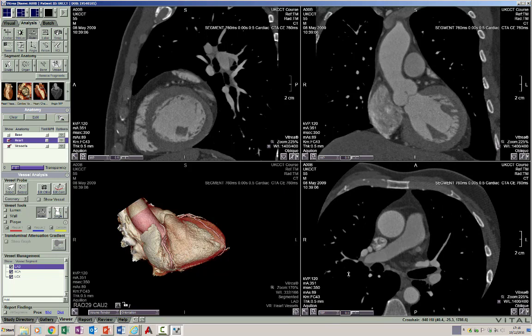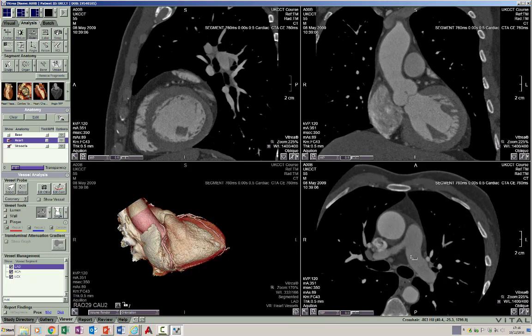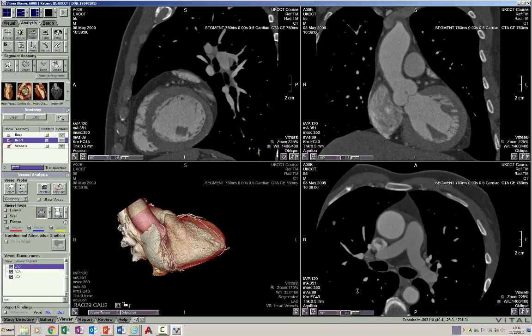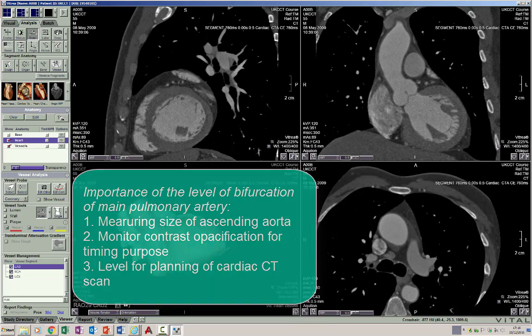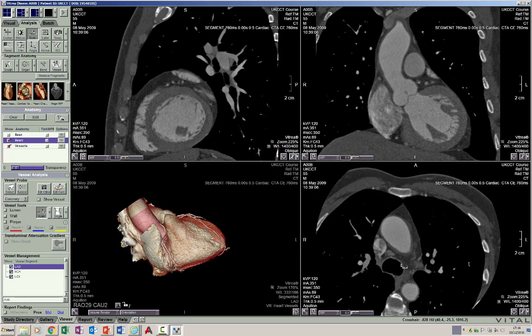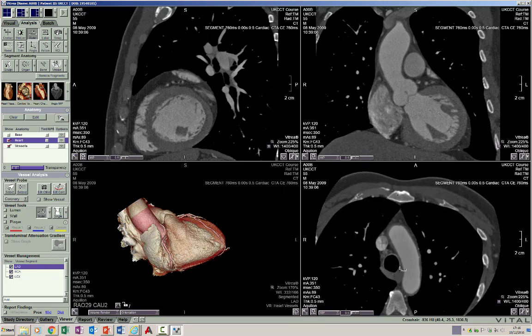The RVOT forms the main pulmonary artery as we go up. We see the main pulmonary artery, the right branch, and the left branch of the pulmonary artery. This is an important level at which we measure the size of the ascending aorta, and where we check for the timing of contrast arrival — either in the ascending aorta or the descending thoracic aorta — and this is the level where we start our cardiac CT scan planning from.